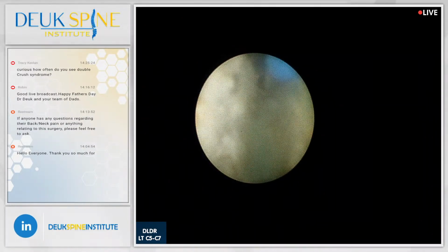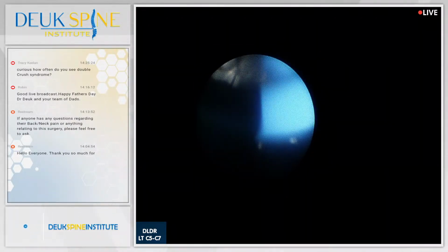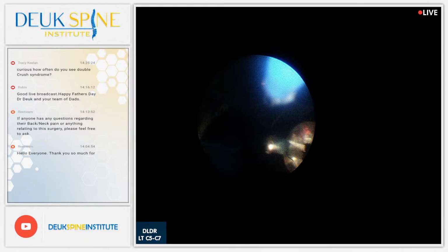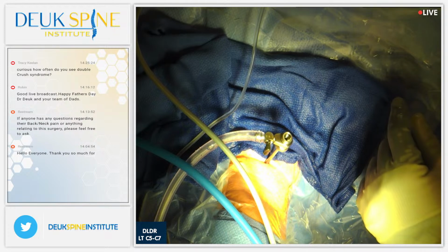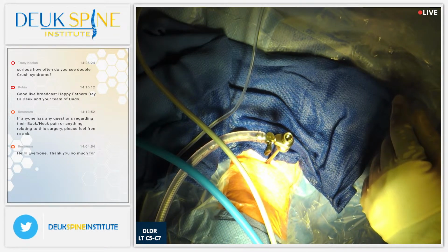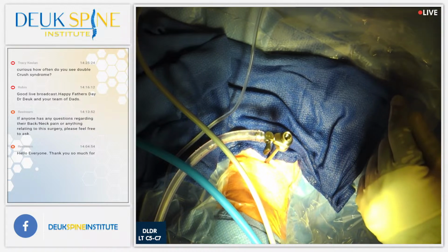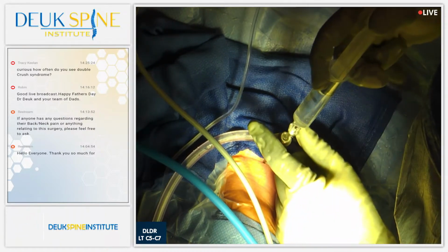All right. Well, I mean, things are looking pretty good back here. Lights on, please. Let's do irrigation. I want to get any loose fragments out. All right, so at this point, we're done with the first disc, folks. We're going to move on to number 2.